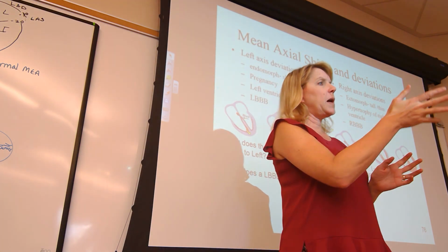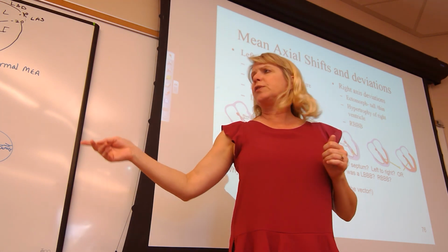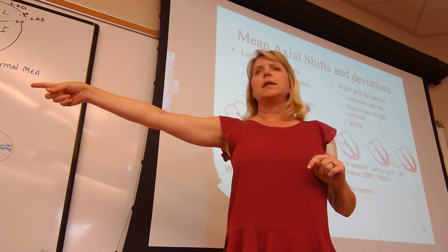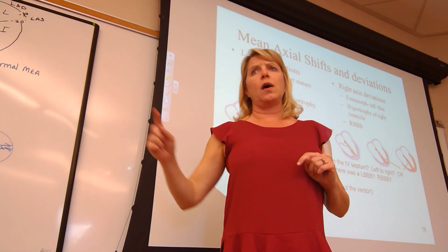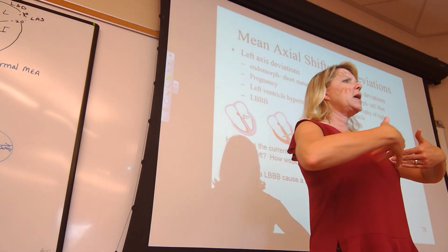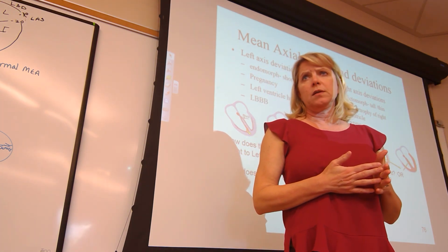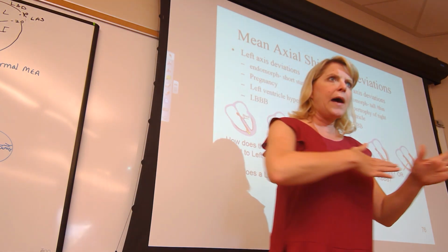Again, Carlos, you might get the AVR and lead 3. Ashlyn, you might get AVL and lead 2. Julie, you might get lead 1 and AVF. That's the forward method. You telling me, based on the 2 leads I give you, what the MEA would be in your patient. Then I will ask you a question or two on the backwards way.